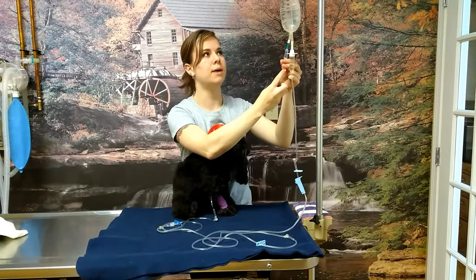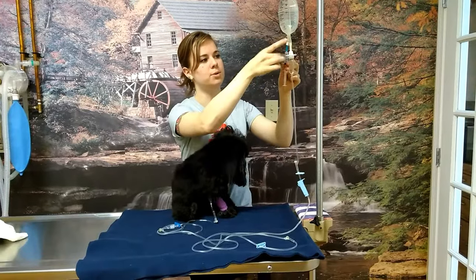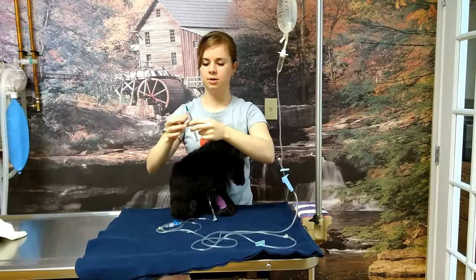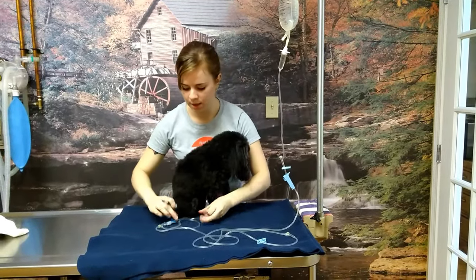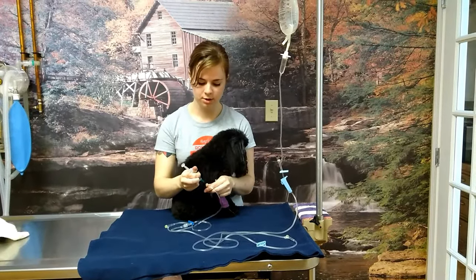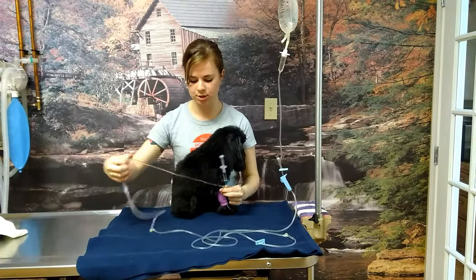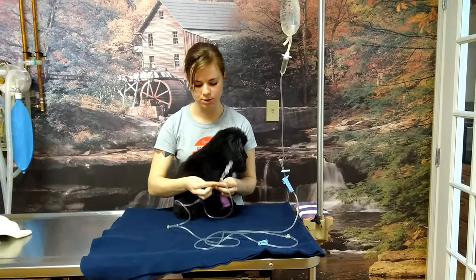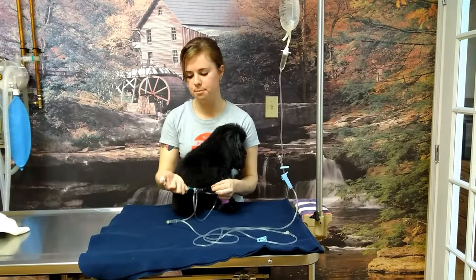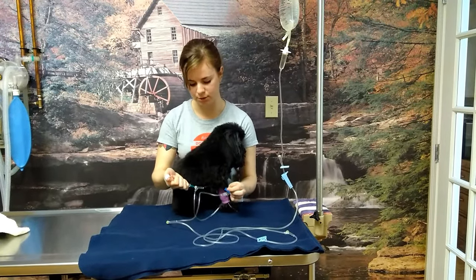Draw up a good amount of the fluid, flick any bubbles out, and push any bubbles out that you find. Then you put the syringe into the port that is closest to your pet, just like that.